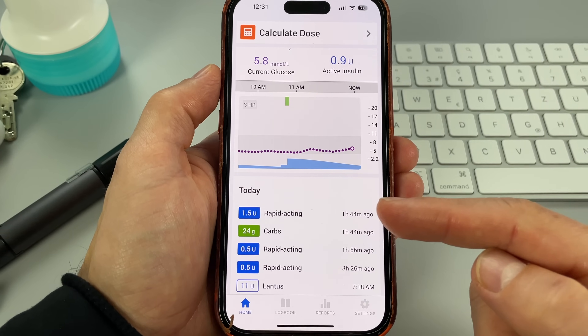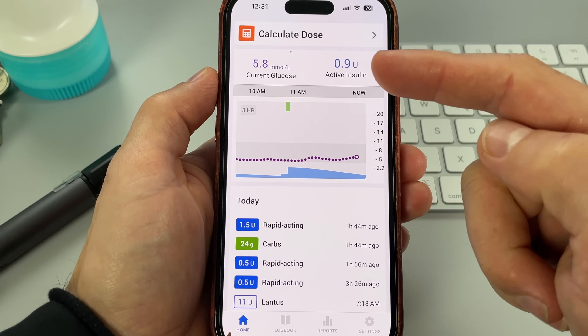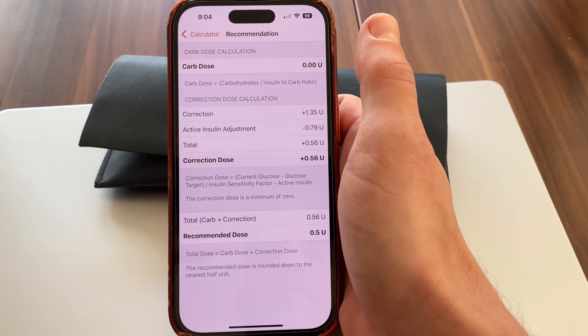Moving on to feature number 3: you know those days when your glucose is high, you take a correction dose but your sugar keeps creeping up? So you do another correction, then another, and a couple hours later your glucose suddenly crashes too low. InPen can help with this because it keeps track of how much insulin I took and how much is still active in my body. The dose calculator takes active insulin on board into account, so I can use it for corrections as well and don't need to do the math myself. Learning about active insulin on board made glucose control so much easier — if you're not using this, you're probably missing out.